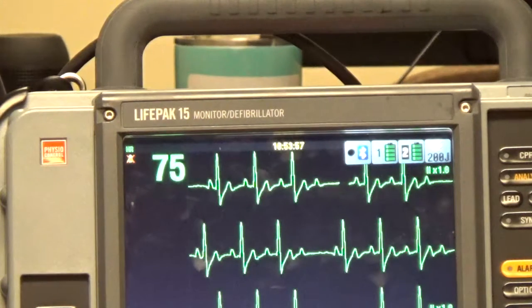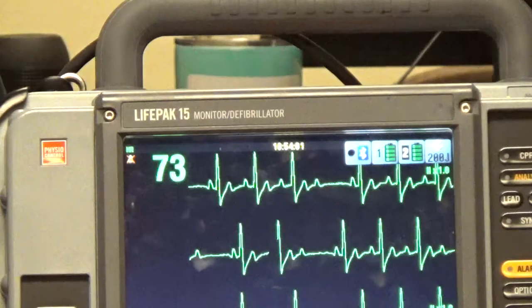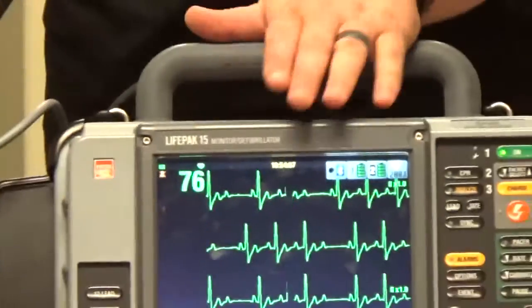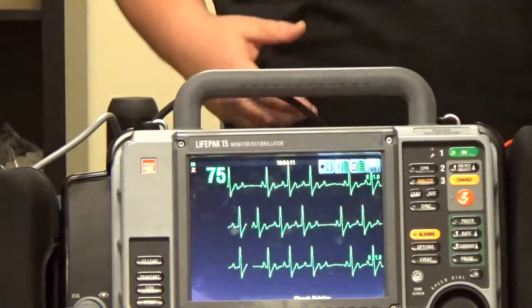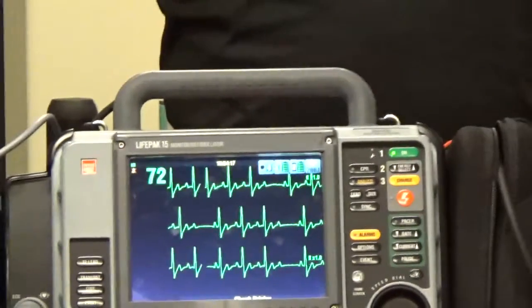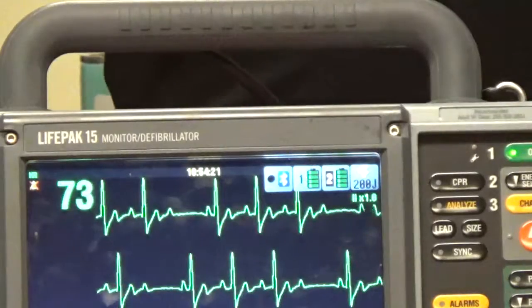Okay, that means there are two electrical impulses coming through the atrium and getting through to the ventricles, and then we lose a beat. Another name for this is the Wenckebach. I like to call it a Wenckebach when I talk about second degree type 1s because it's easier to describe. Remember, the number one way to determine a second degree type 1 is what happens to the PR intervals. They widen, widen, widen, drop a beat.